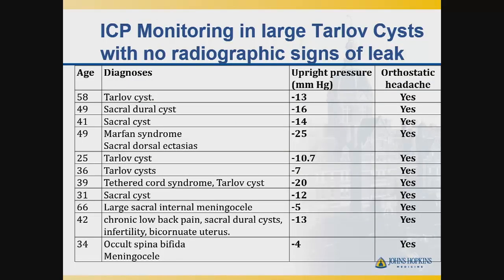We've done ICP monitoring in about 10 patients with Tarlov cysts, and some clearly had low pressures, whereas in some, pressures were normal.